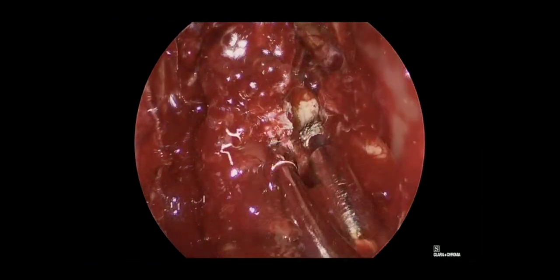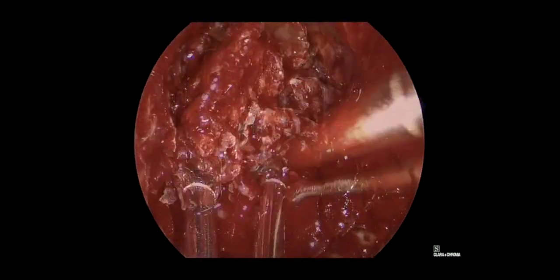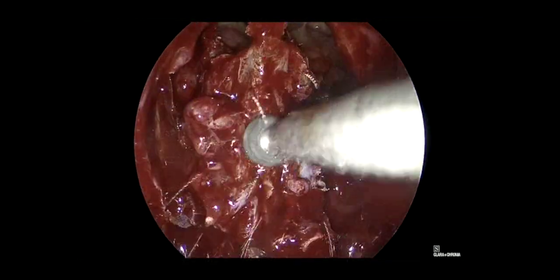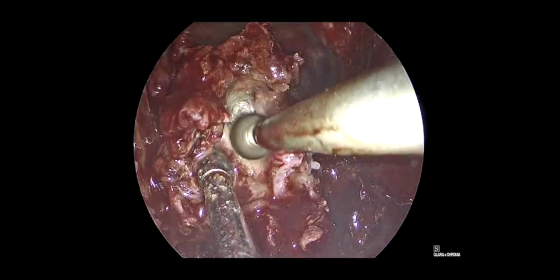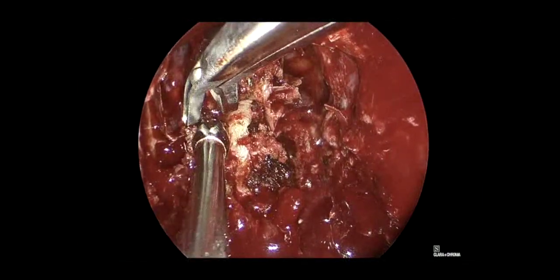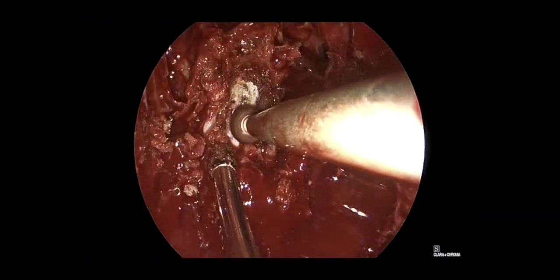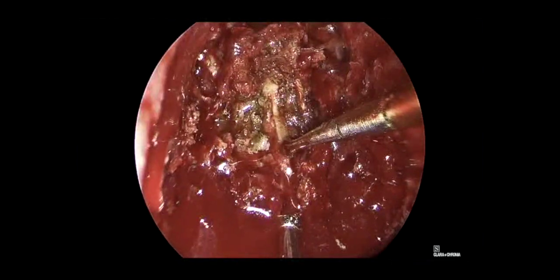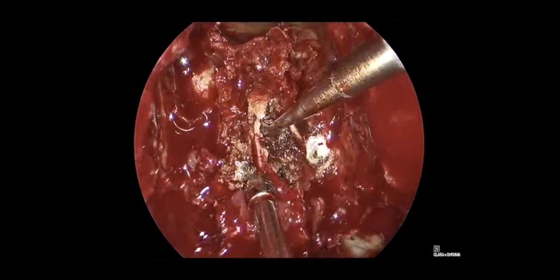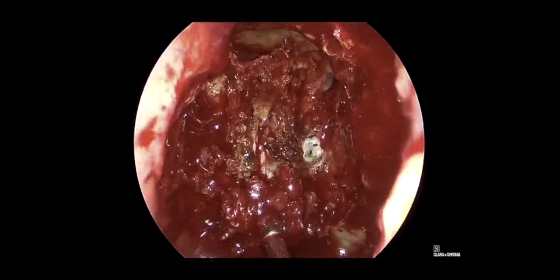Once that's done, my neurosurgical partners come into the field, and you'll see drilling along the crista galli and a bit laterally. The key aspects for the cranial base resection are to drill and free up the crista galli centrally. This generally needs to be drilled down and come out in a few pieces by lifting the dural leaflets around it on either side. Here we are now exposing the bone anteriorly and drilling down that thickened crista galli. These are micro-true cuts, which are especially helpful along the thickened area of dura and around the olfactory fila. Now here's that larger piece of crista galli coming out, allowing the bone to be removed and providing more soft tissue access.